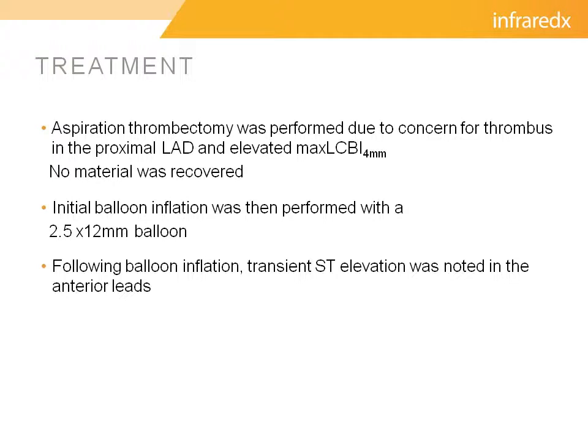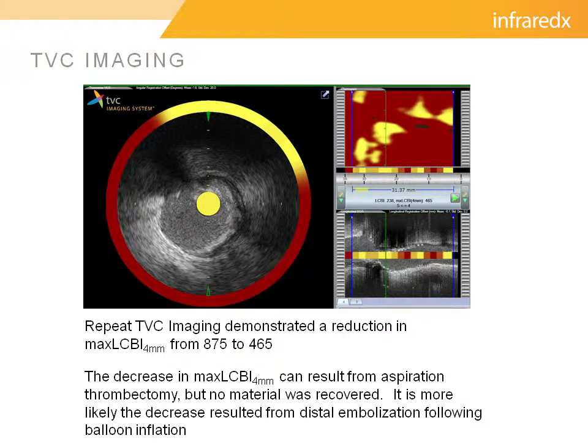Right after the balloon inflation, the patient developed transient ST elevations in the anterior leads and complained of some mild chest discomfort. The NIRS-IVUS catheter was reintroduced, and it was very interesting to see that our lipid core burden index had actually dropped from 875 to 465. Our theory was that the thrombus and plaque burden had actually migrated distally into the distal LAD after our balloon inflation, although some of it may have been reduced due to aspiration thrombectomy, but as mentioned previously, we really didn't get much material back from our aspiration catheter.